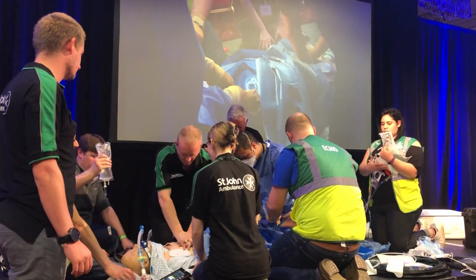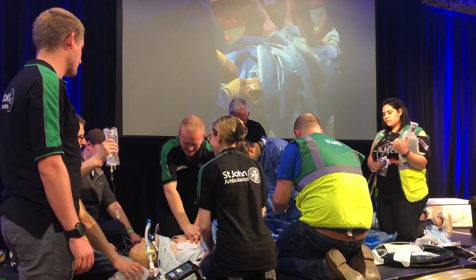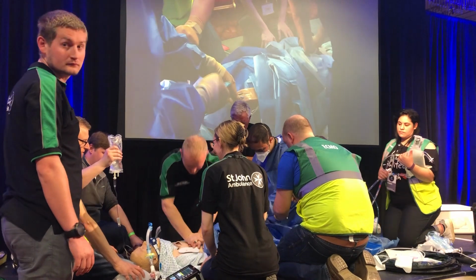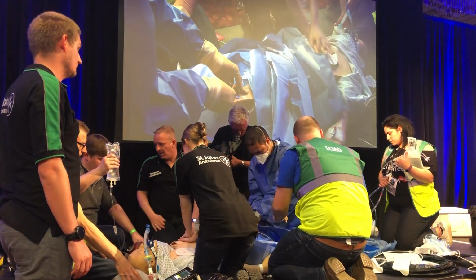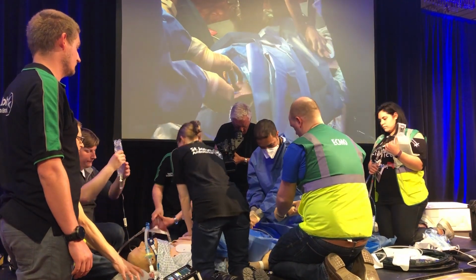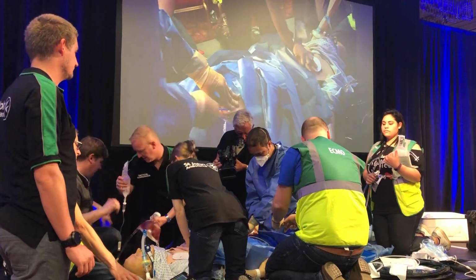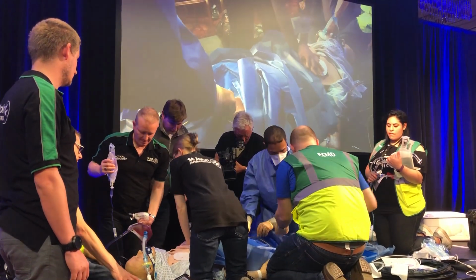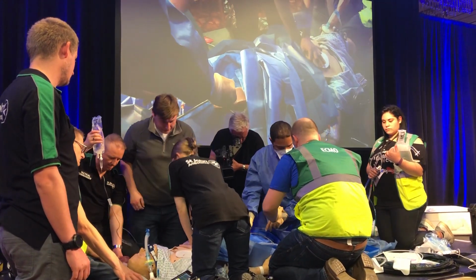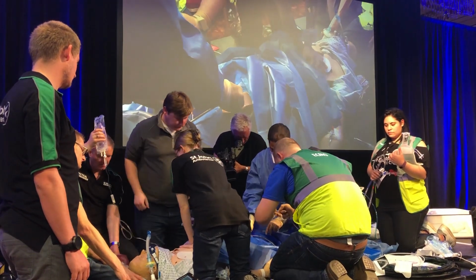So another question we get is, now we've committed to ECMO, what would happen if you suddenly got a ROSC at this late stage? And the answer is almost certainly we would go on to ECMO anyway. Okay? The vast majority of people that we put on ECMO aren't in cardiac arrest. They just have heart failure, they're in cardiogenic shock. And after this amount of CPR, this patient is going to have a degree of cardiogenic shock.